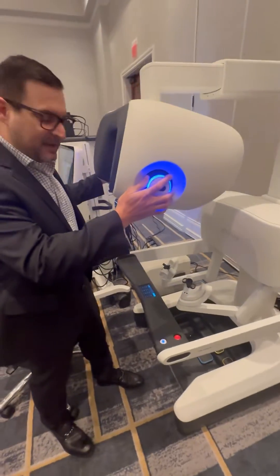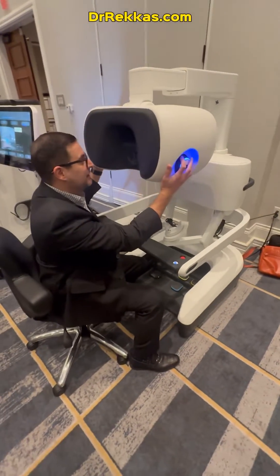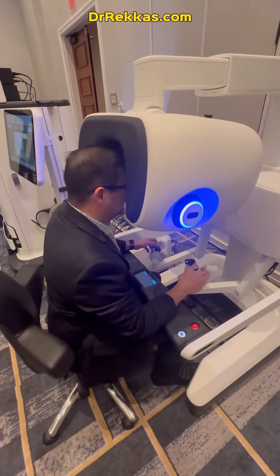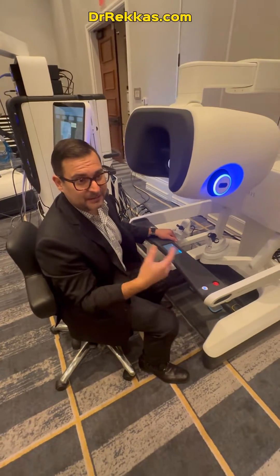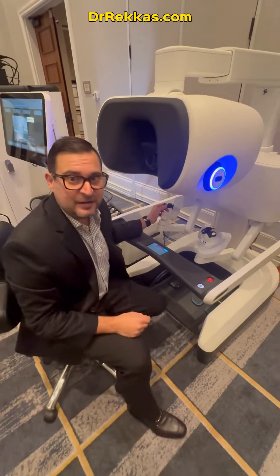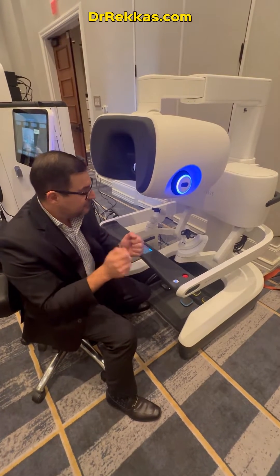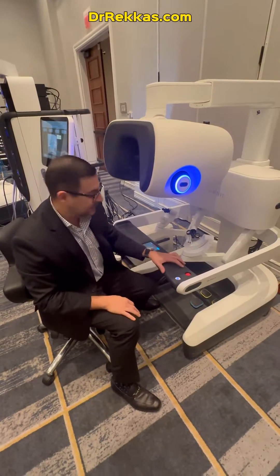This is the new DaVinci 5 console where the surgeons sit. This has been dramatically changed. Now instead of just having a fixed location where I'm looking down, this whole area is highly maneuverable. It's much more comfortable and it's going to allow surgeons to be a lot better at ergonomics. The controls are very similar. There's something called advanced force feedback, so I can actually feel when my instruments are touching pieces of tissue and sutures — a tactile feedback we never really had before in any robotic technology.